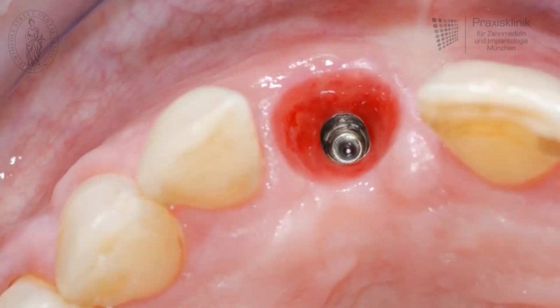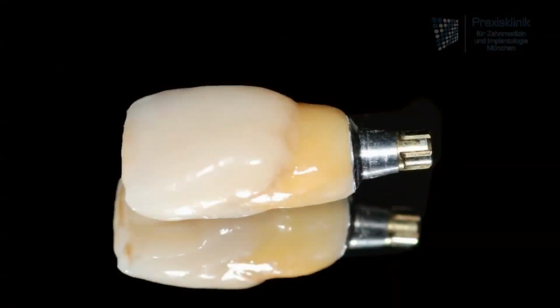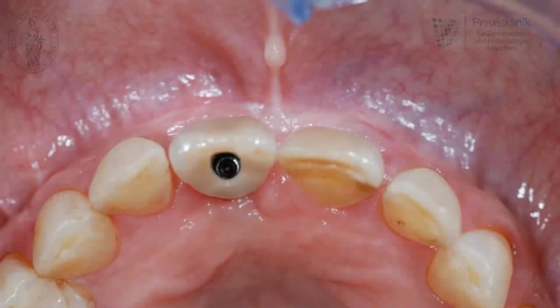In the next step, the soft tissue around the implant has to be formed. Normally we do this by having a fixed temporary crown which is screwed into the implant. For the patient this is very comfortable because he has a fixed temporary solution until the definite restoration is fabricated. The definite restoration is a screwed single crown made of ceramic.